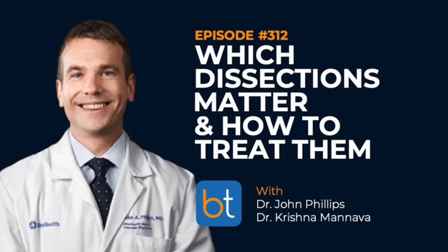It's not meant to, because I don't kiss them really, and so I try to separate them. You can kiss them if you need to, because when you start using them, you're going to miss, and physicians don't like missing. We don't like geographical miss, but you're going to have it. You just have to understand that. And I was telling the sales force too, you guys need to tell docs that these aren't as accurate as you might think early on, so you're going to get some misses.